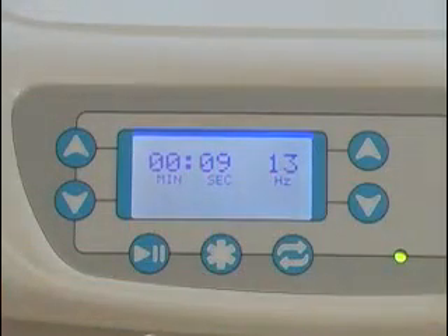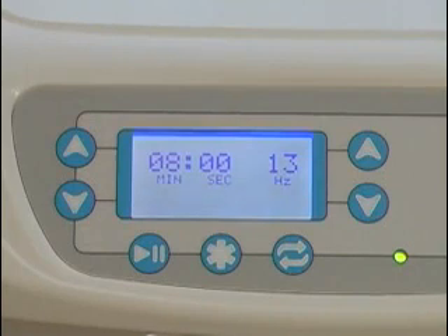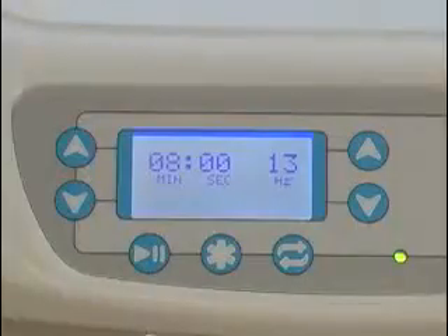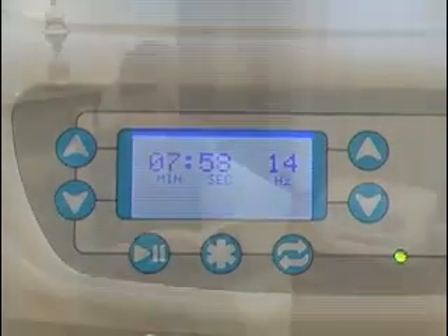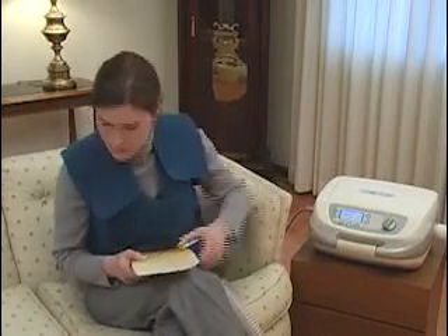Returning to the display, you will see that it counts down the time remaining for the current treatment segment. When the timer reaches zero, the air pulses will stop, the unit will beep twice, and the display will return to the setting you started with. The air pulses created in your airways will have loosened and mobilized the secretions. You can then perform your directed huffing and coughing to remove them. When you are ready to continue your therapy in Manual Mode, set the time and frequency to your next treatment segment and press the Start button. Please note that if you ever need to pause the treatment, simply press the Pause button and the air pulses will stop.